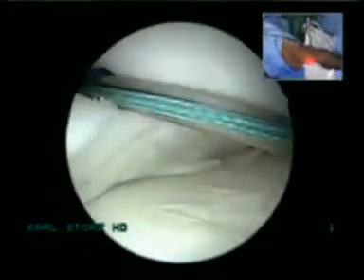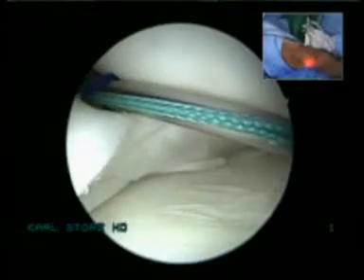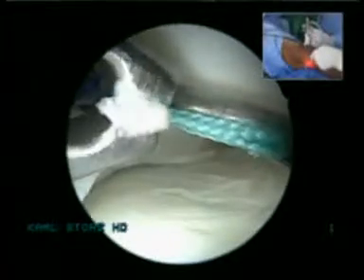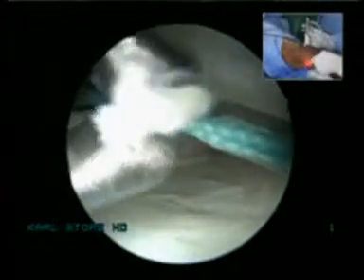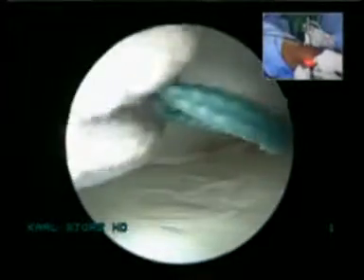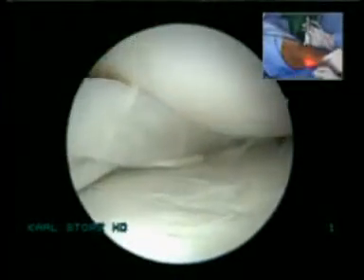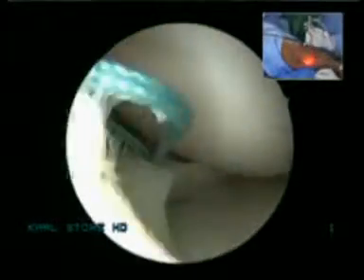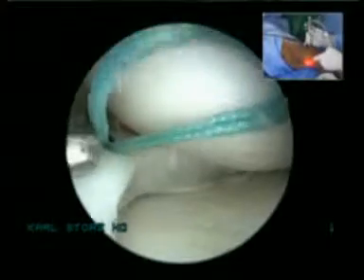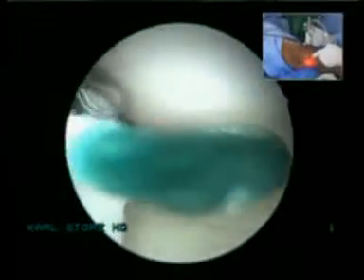High class sportsman, especially the professional player, couldn't give a damn about the fact that his knee starts to fail when he's 35, 38, 40. What he wants to do is get back to playing straight away. Pull the needle back. The cannula. So in many respects, you take more meniscus out in the higher class sportsman than you do in the lower class. Oh, that's interesting. Otherwise, the professional career will be in jeopardy. Yeah, exactly.